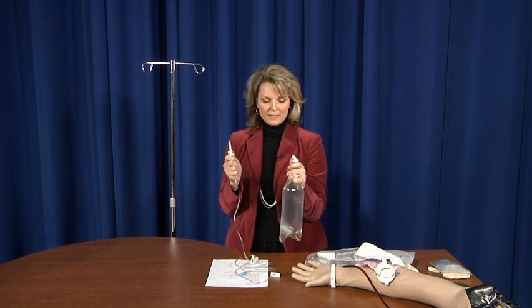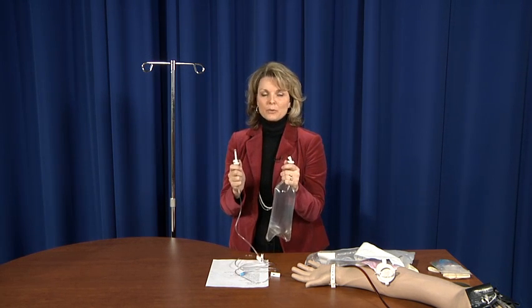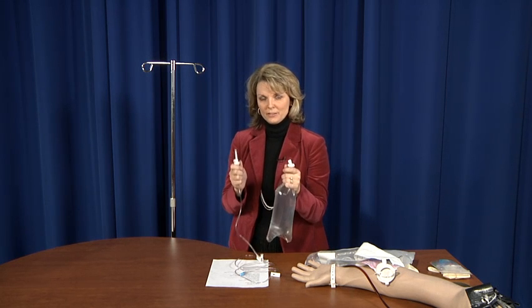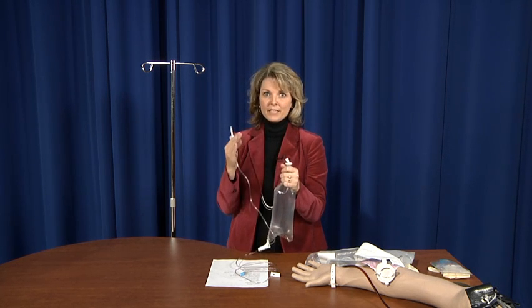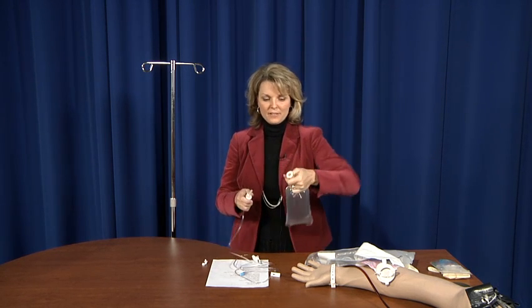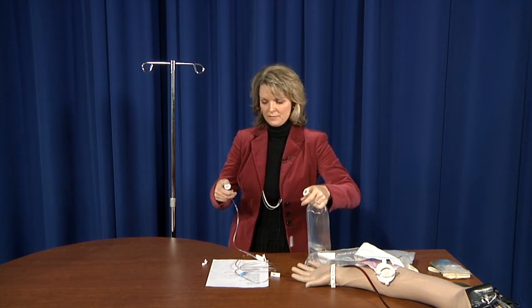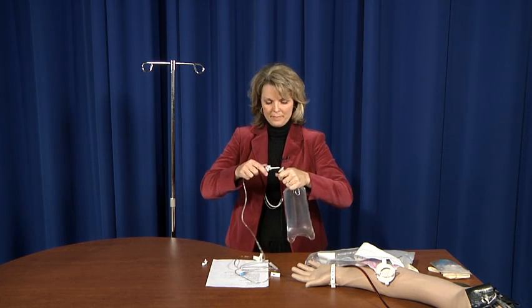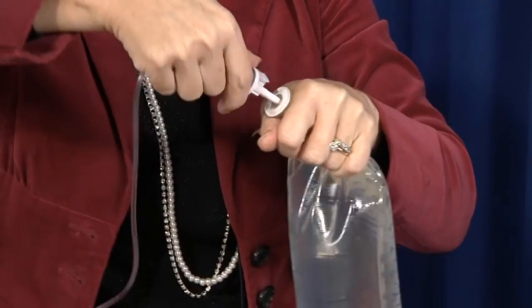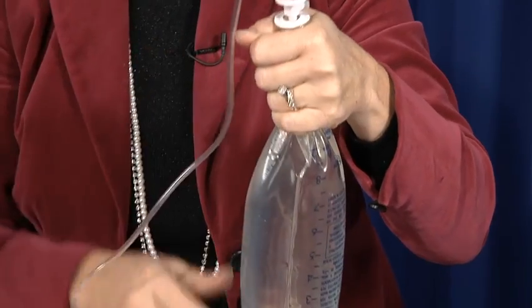This is very important. We have to insert this spike into this hole, and it's sterile, so we want to maintain sterility. The way we're going to do that is be very careful of where these ends are going. We want to pull this. As you can see, it's kind of tough. I'm not touching that. There's the hole. Twist that off. This is your spike. Gently twist until it comes all the way.